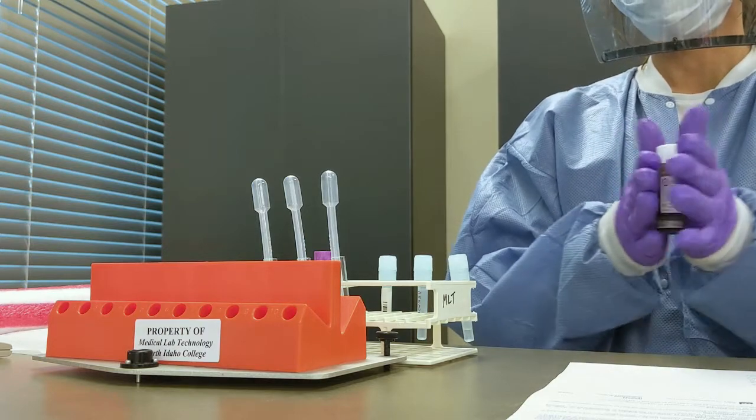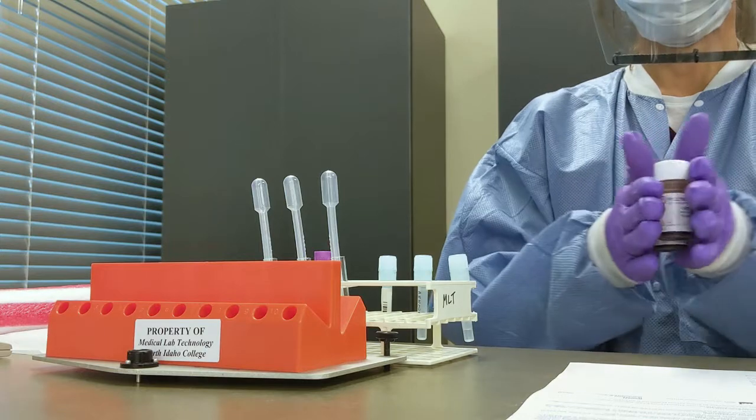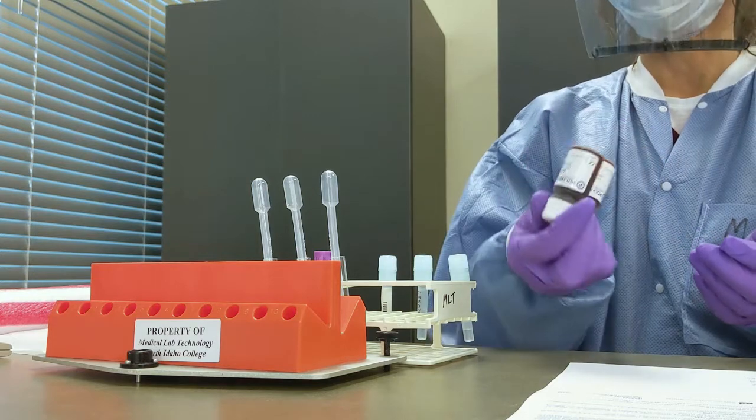We're going to demonstrate an erythrocyte sedimentation rate, also known as SEDRATE and ESR. We're going to use the term ESR moving forward.